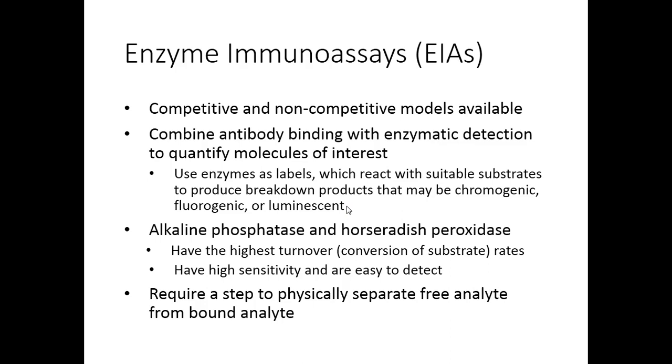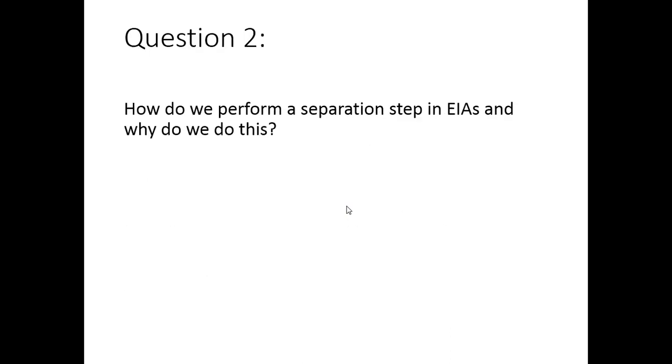I think at this point we all understand why it's so important to do a separation step. But as a reminder, it's important to wash or separate free analytes because, as we said before, free analytes can still react with the substrates within the test system, causing a false positive reaction. So it's really important to separate any unbound analytes or reactants.